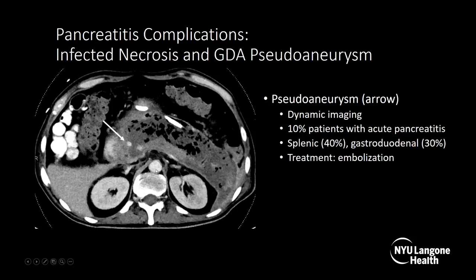Here's another example. On this axial CT with IV and positive oral contrast, surrounding and replacing the pancreas is a heterogeneous collection with dense areas — pancreatic necrosis — with air bubbles throughout, confirming infected pancreatic necrosis. The arrow points to a blush of contrast matching the aorta, which is a pseudoaneurysm arising from the gastroduodenal artery. Pseudoaneurysm requires dynamic imaging for diagnosis, occurs in 10% of patients with acute pancreatitis, with 40% being splenic and 30% gastroduodenal, and treatment is embolization.